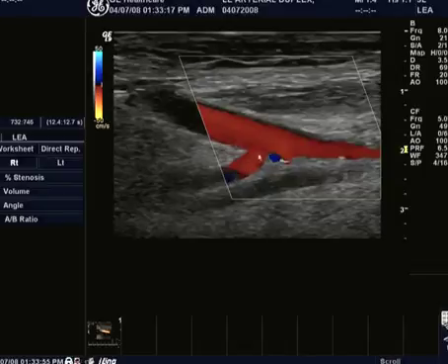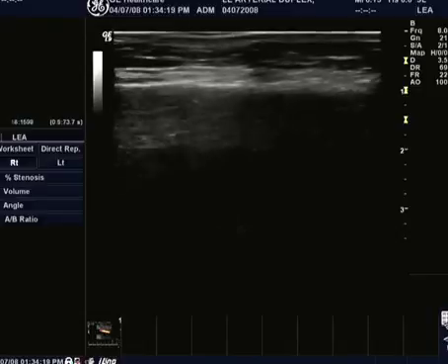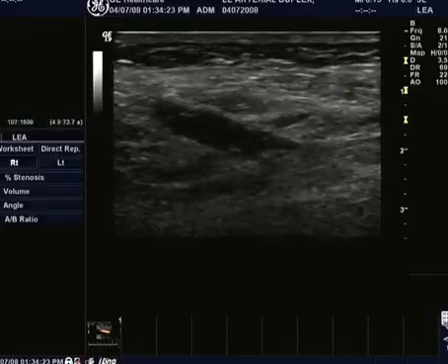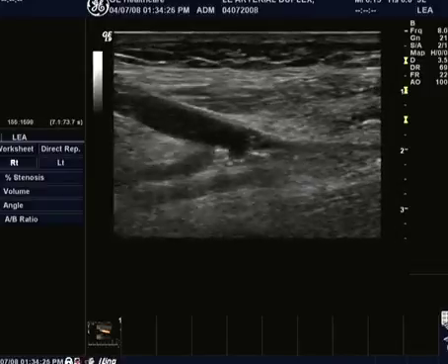They leave this just like this so we can get a little bit of retrograde flow up into the vessel to perfuse any branches or collaterals that may be present. So that is really what we'd like to see, and we know that that's functioning well. On the color image, we see no real signs of any aliasing. Good, again, good color filling all the way out. Let's go back and take a look at it in B mode or grayscale and see what the grayscale tells us.